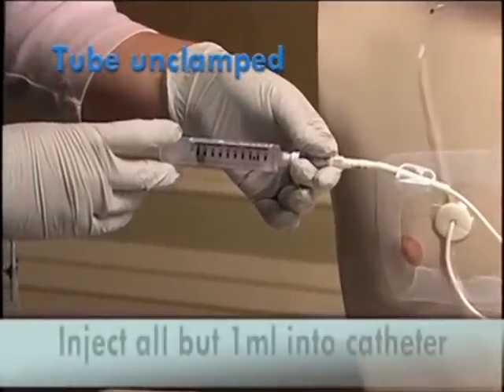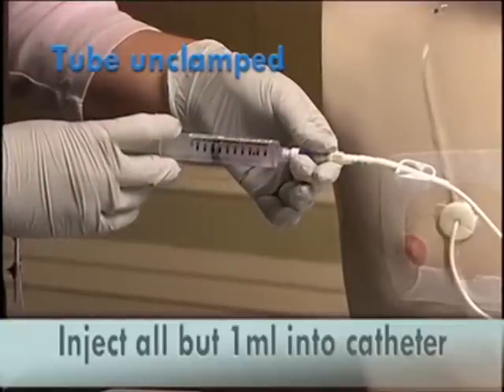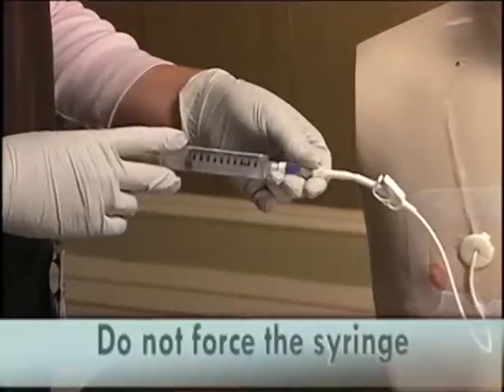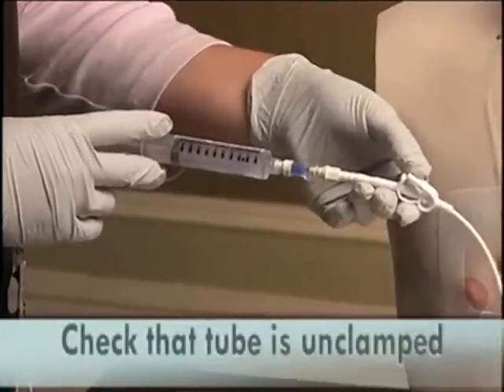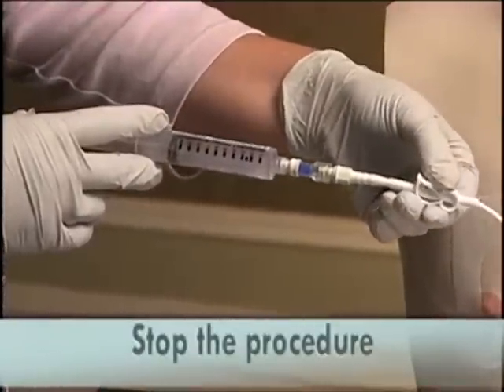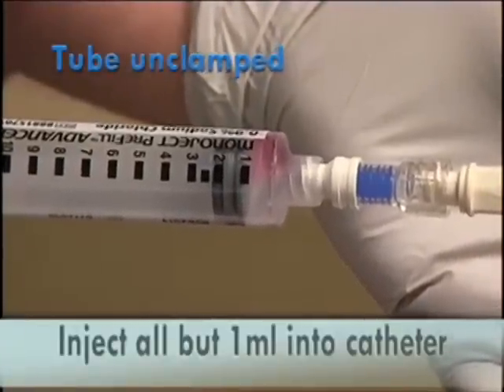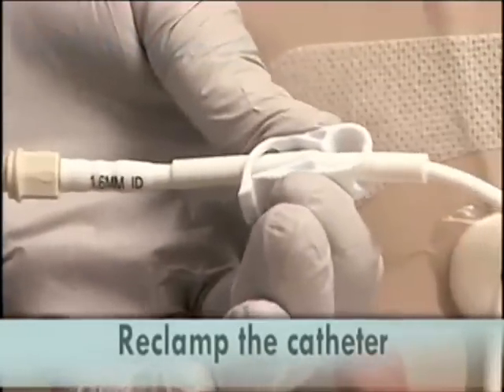Slowly push the plunger of the syringe to inject the solution. There should be no resistance when attempting to instill the solution. If there is resistance, do not force it. Check that the tube is completely unclamped. If it is, discontinue the procedure and call your home care nurse promptly. When the syringe is almost empty, with approximately one milliliter left, reclamp the catheter.